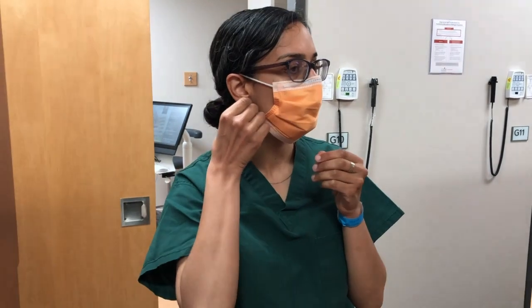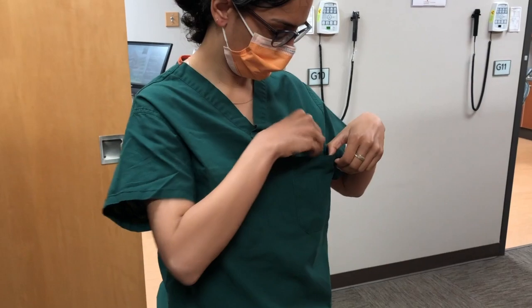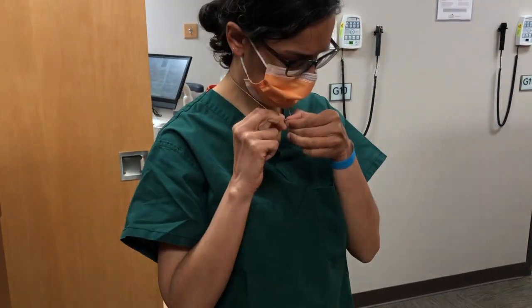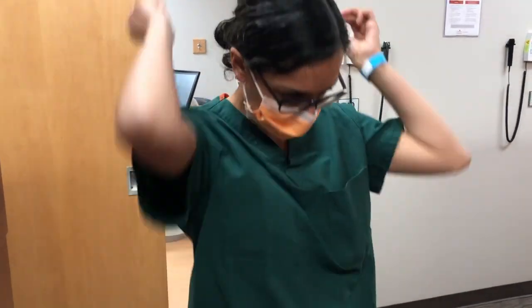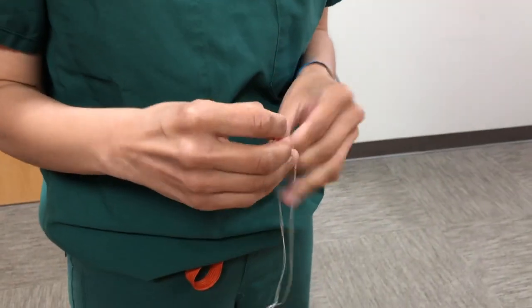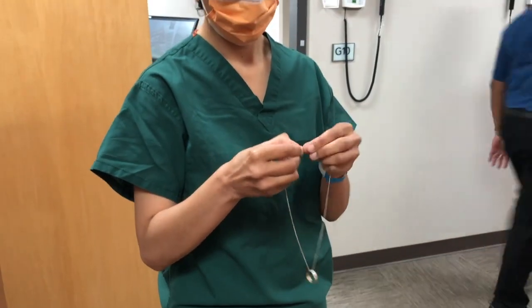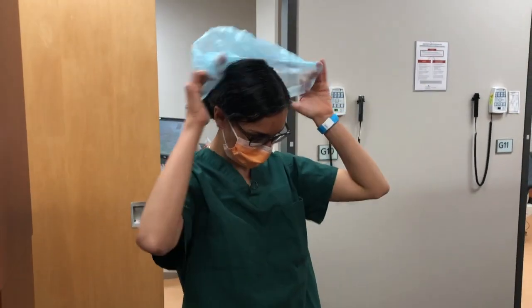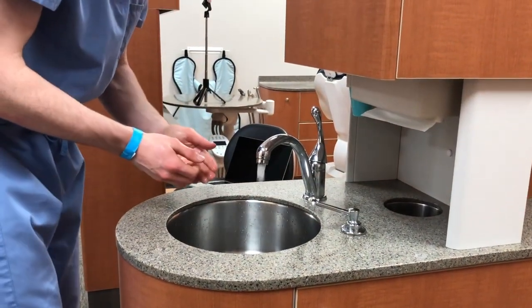Tie up long hair, and the best place for a ring is on a chain around your neck. If you can avoid bringing jewelry into the dental school entirely, that will save you performing these steps. You can now place your bouffant or surgical cap, making sure to cover all your hair.